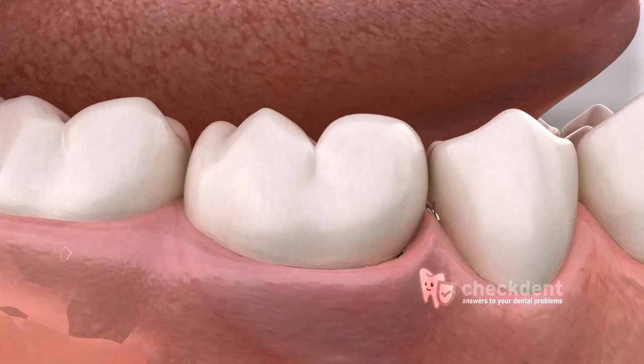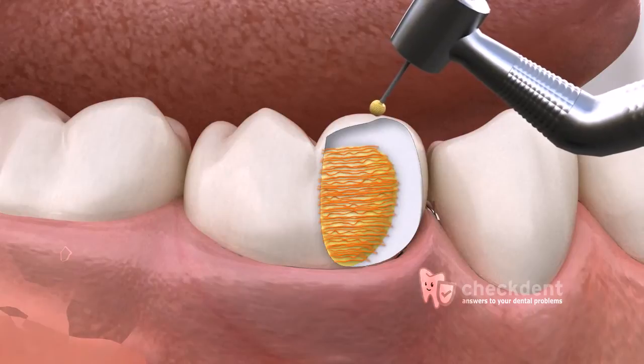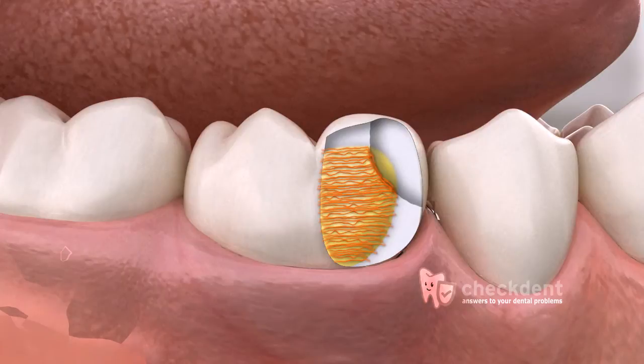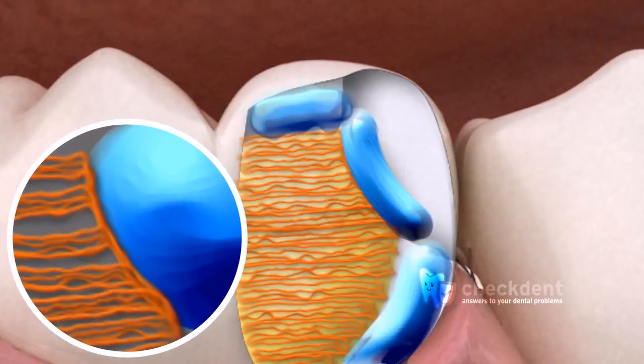However, all parts of a tooth cannot be etched equally. In the animation, the dental enamel is being removed with a drill. Enamel is a mineral. Below the enamel, there is dentin. Dentin consists of protein strands and small channels. These structures are destroyed during the drilling procedure, literally forming a pulp that is technically termed as smear layer, represented by the grey mass in the animation. The smear layer prevents the glue from penetrating the dentin. In addition, if the etching gel were applied on the enamel and dentin for an equal amount of time, the proteins released in the dentin would form small lumps because of the etching gel.